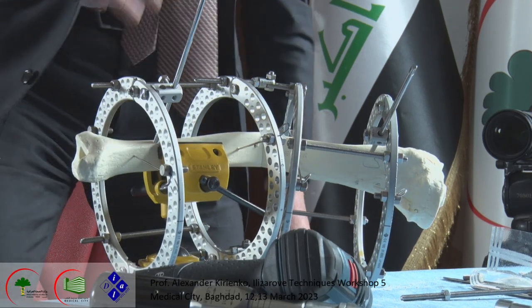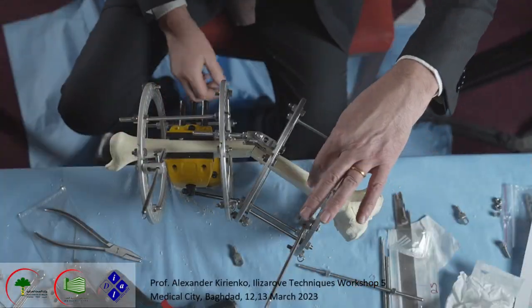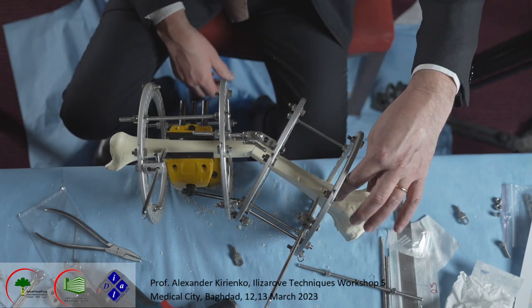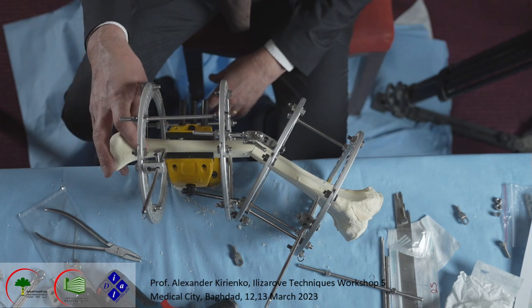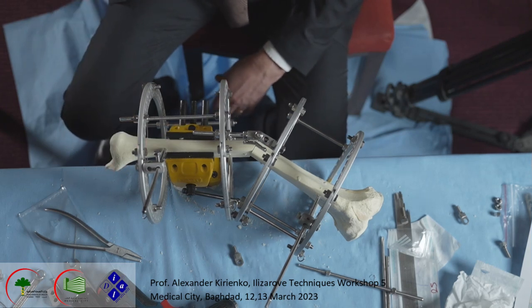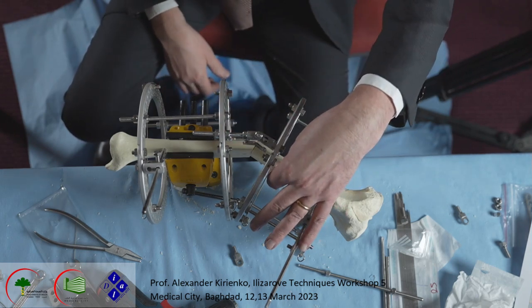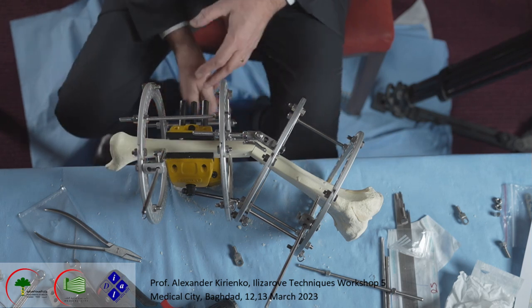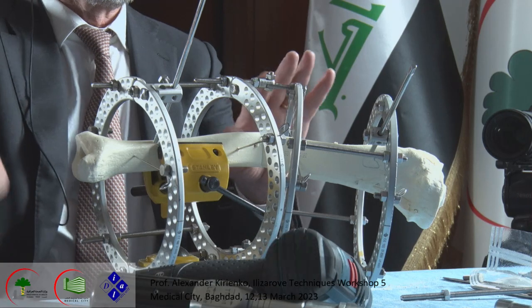Obviously, we may stabilize the frame much more. If you want to continue, we may put another half pin, another wire here, proximally. We may put another wire distally. If you are not sure about these two wires, we may put a half pin here, but we don't need to do stabilization now because what we need to know now is how we position the hinge.